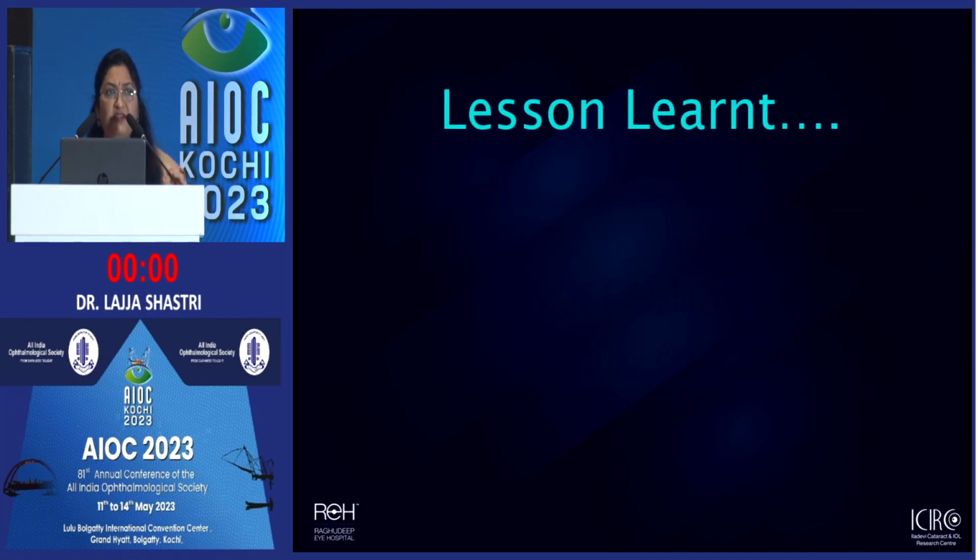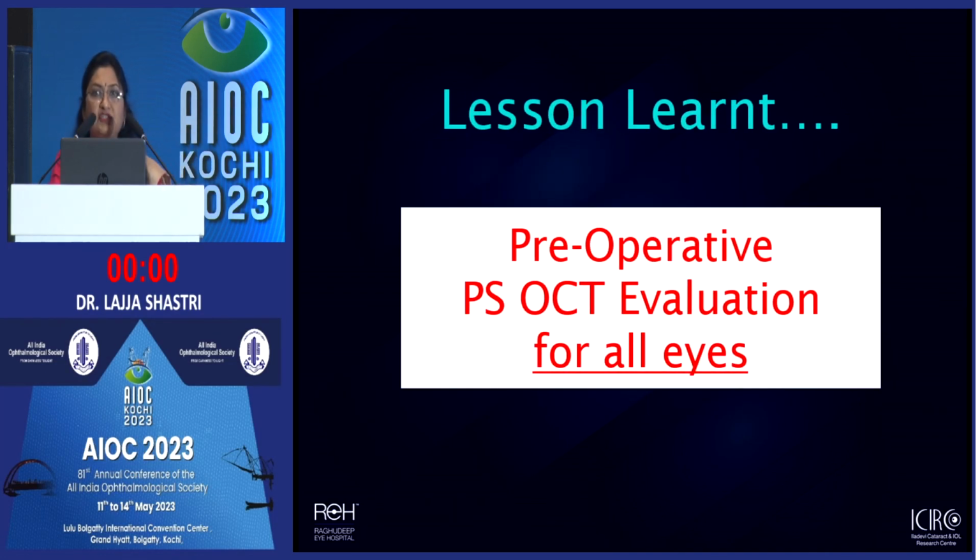And one very important lesson, like what Dr. Samresh also mentioned: preoperative PSOCT evaluation. I cannot tell you how many times it has saved me from a very embarrassing result and an unhappy outcome. Getting it done for every patient planning to undergo multifocal lens evaluation is a very important thing to do in order to ensure a happy outcome.